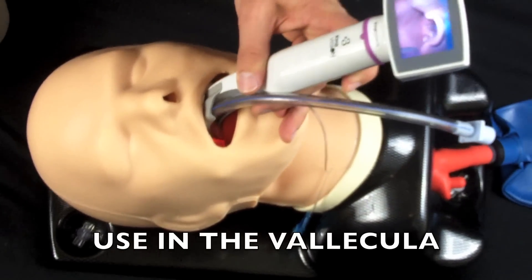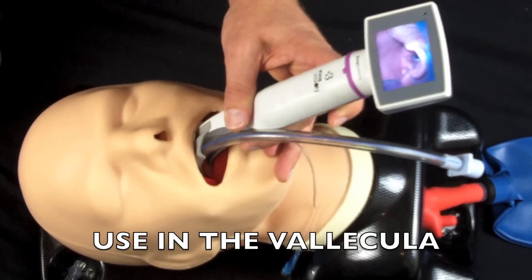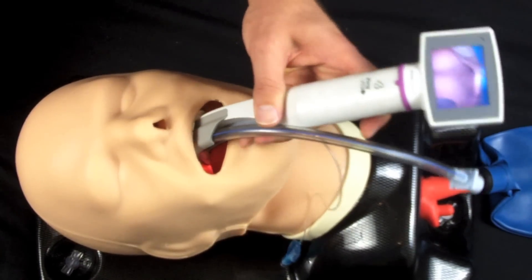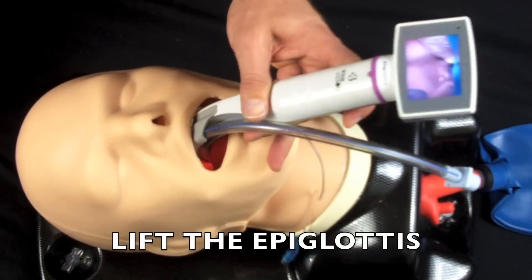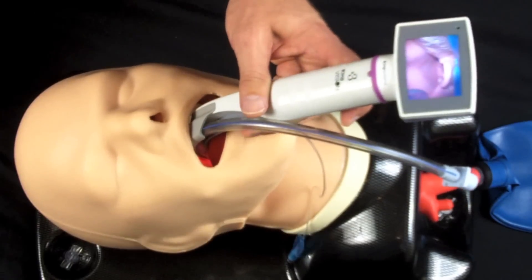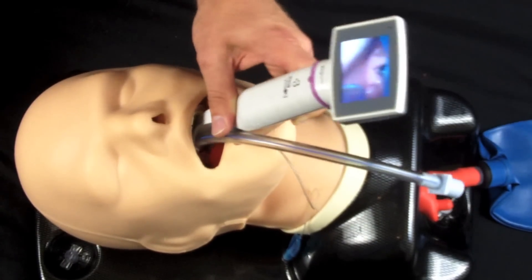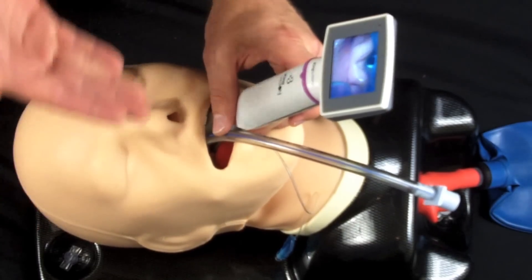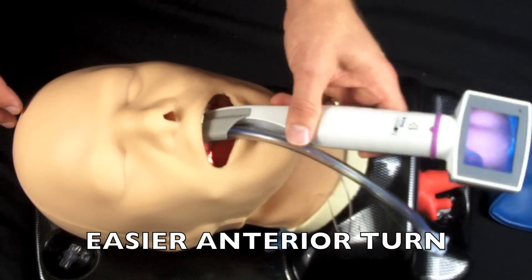We want to make sure that we either use it like a curved blade like we're supposed to and put it in the vallecula and let the epiglottis open up, or we grab the very tip of the epiglottis. Either way is going to work well. What you don't want to do is end up going all the way down here, especially on a patient that's as closed as this patient is, because it's going to make it very hard to make the anterior turn.